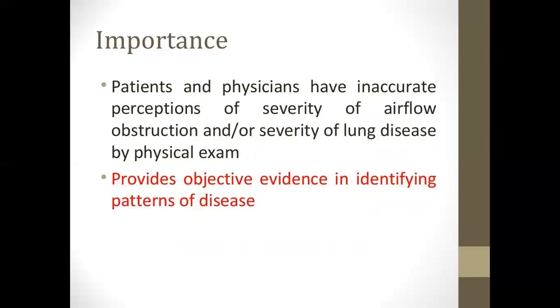Its importance: patients and physicians have inaccurate perceptions of severity of airflow obstruction and or severity of lung disease by physical exam. It provides objective evidence in identifying patterns of disease.